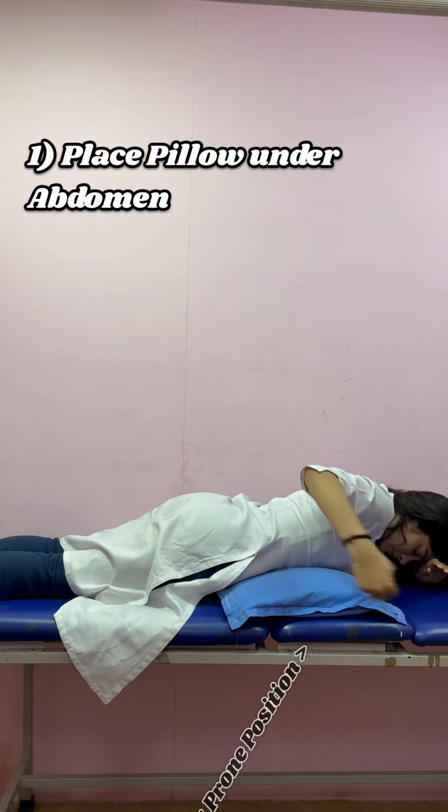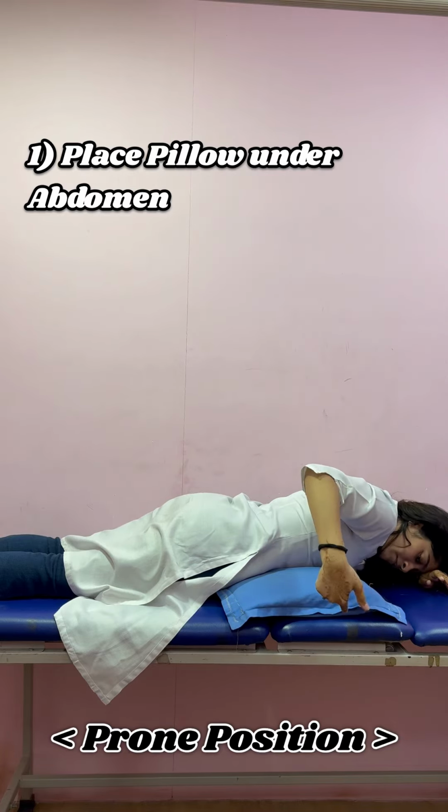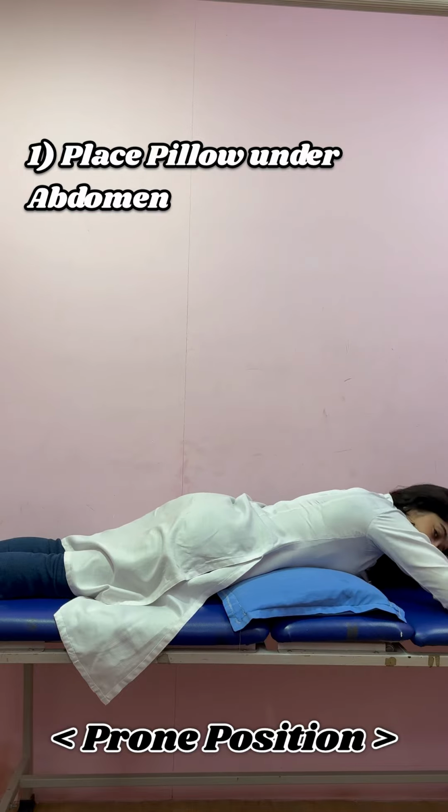The second position being prone position, that is facing down. There's a pillow that has to be placed under the abdomen so that it reduces the pressure on the abdomen and the spine.